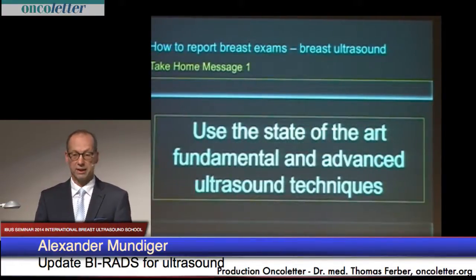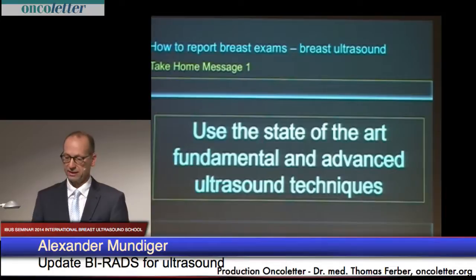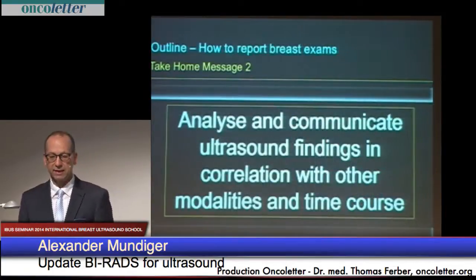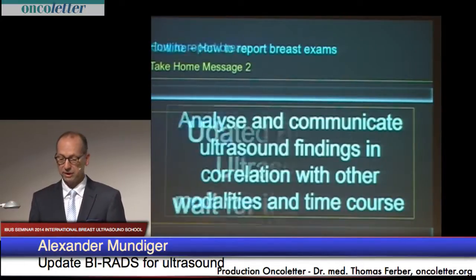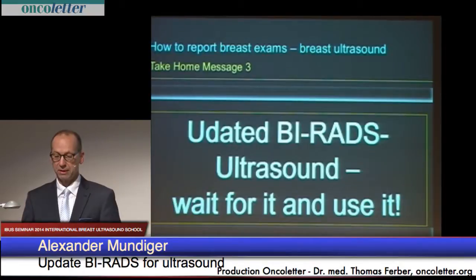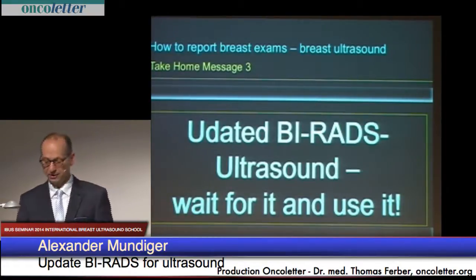And here are the take-home messages. First, use the state-of-the-art fundamental and advanced ultrasound techniques. Second, analyze and communicate ultrasound findings in correlation with other modalities and the time course. And third, the update ultrasound will come, definitely. Wait for it and use it.